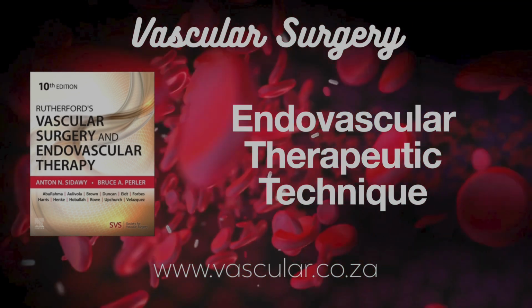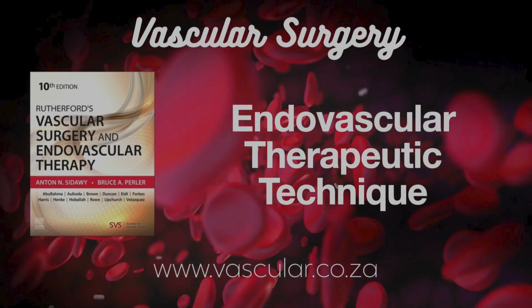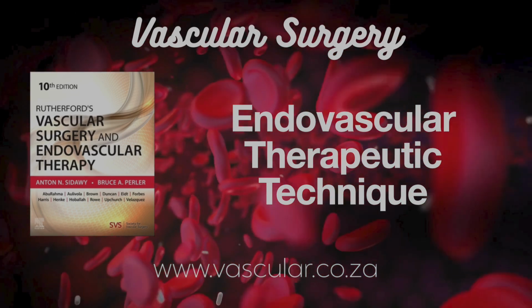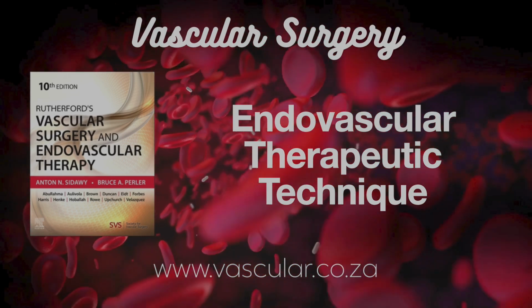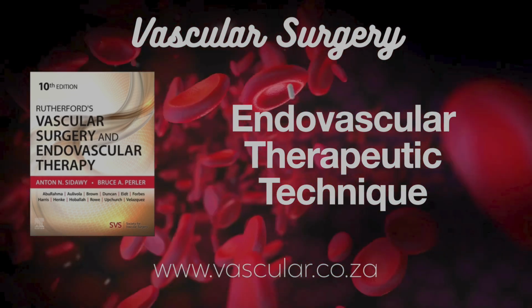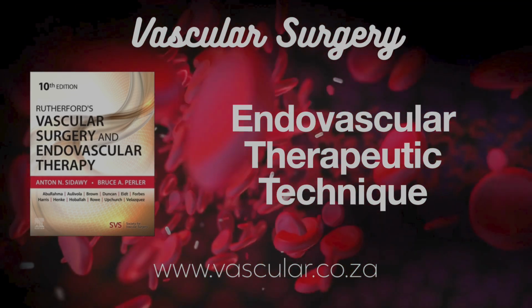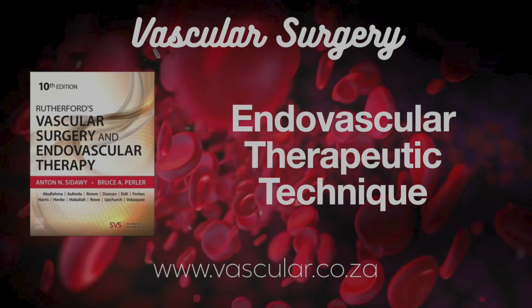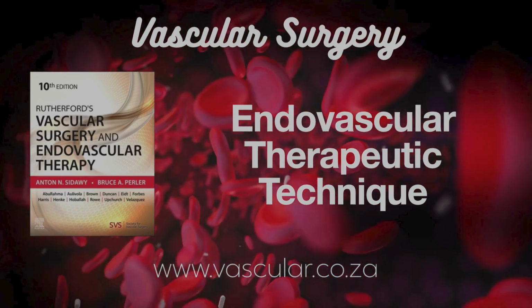That's the hope. Another major use is in those no-stent zones we talked about, common femoral, popliteal artery near the knee, where you really want to avoid leaving a stent if possible because of the high risk of fracture. Removing plaque instead of just squashing it might improve flow enough without needing a stent there. Makes sense. The source outlines 4 main types: directional, rotational, orbital, and laser. Let's start with directional. How does that work?